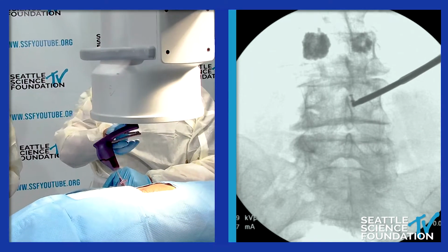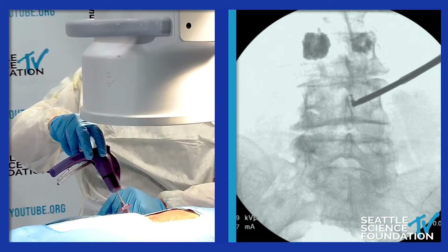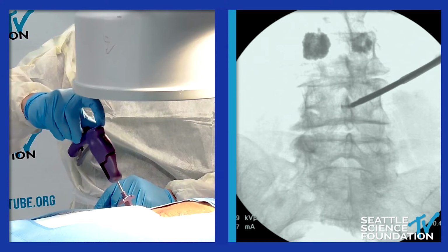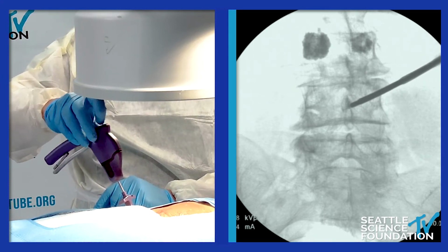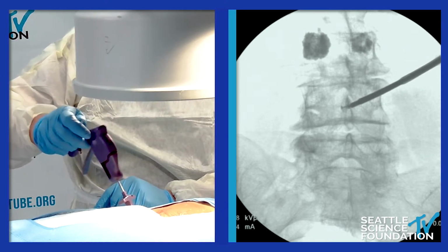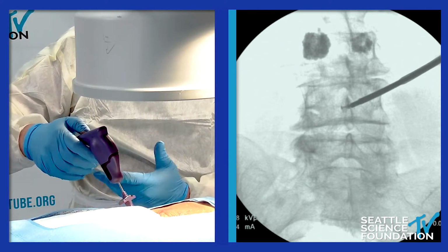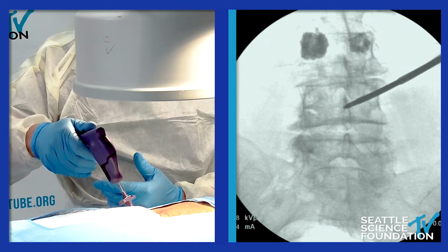A lot of times we'll core it out. Let me go live. We'll core it out. Okay. And do it at different depths, of course. And you see I'm crossing midline there, which enabled me to get the balloon across as well.